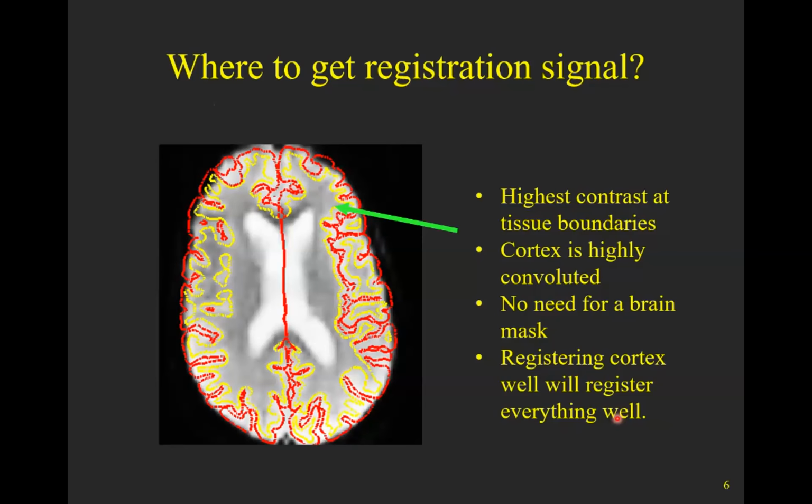So a question comes up as to what the registration algorithm is going to be doing, because what it's going to be doing is computing some kind of cost. So for each instantiation of those 6 parameters, you're going to get some alignment between the anatomical and the functional. And for that alignment, you have to compute some type of cost. And then the idea is that the computer is going to change this alignment to follow the cost down to try to minimize that cost.